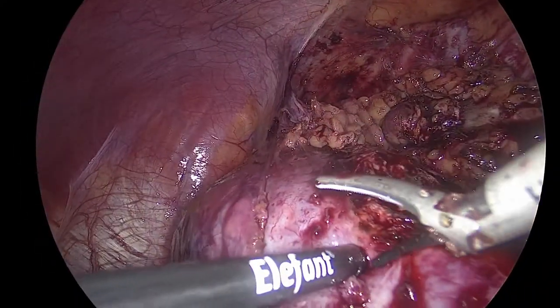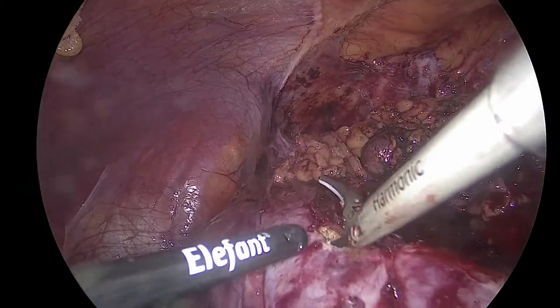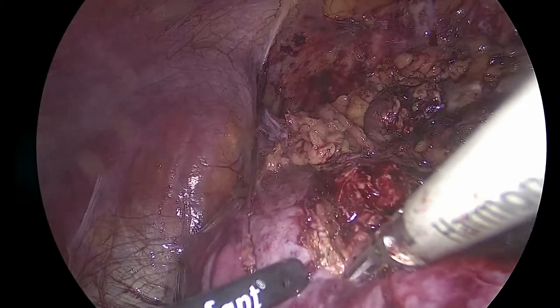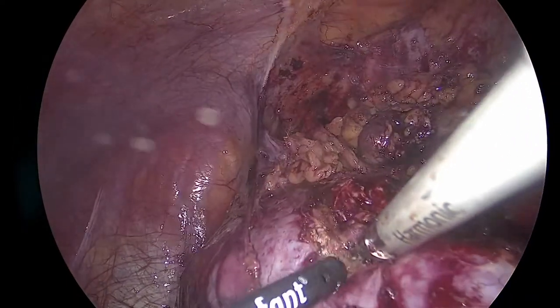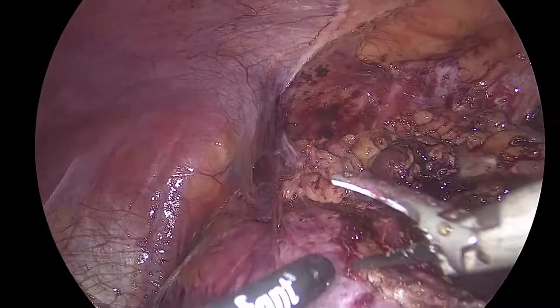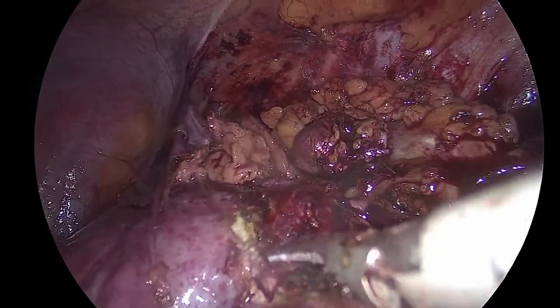First of all, I will go here and make a small incision like this. Show me. Good. I stay away from the tumor bed now because now we want to take out these segments and make sure that we don't have a bleeder, we don't have positive margins, we need to stay away from the tumor bed. Stay vertical. Come in. Come in, close. Good. This is parenchyma for sure here.